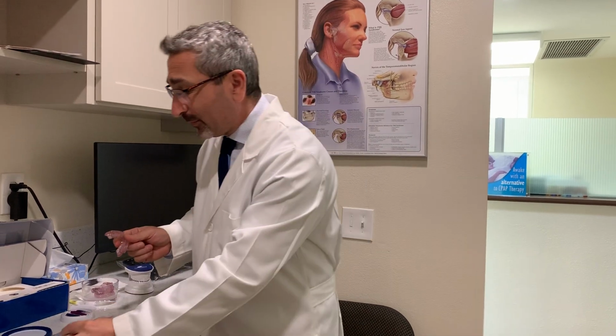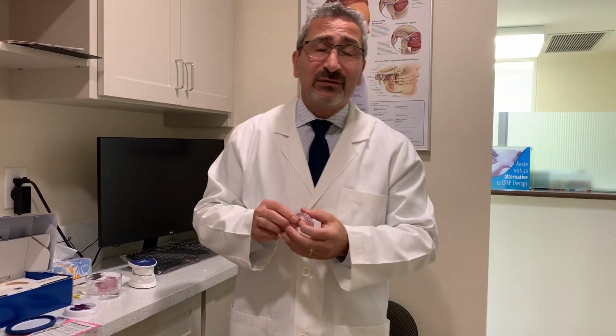As far as cleaning solutions, best thing to use based on the instructions given by Somnomed is to use a detergent type soap like Dawn or Palmolive. And if there's a little bit of extra toothpaste left on your toothbrush, that's okay to scrub it and clean it. But by you keeping it clean will make these mouthpieces last longer.